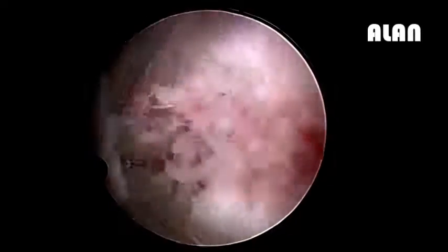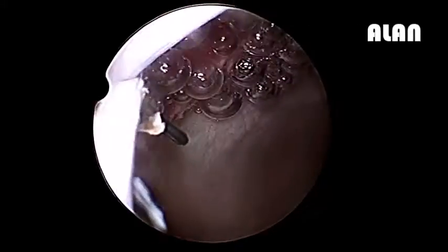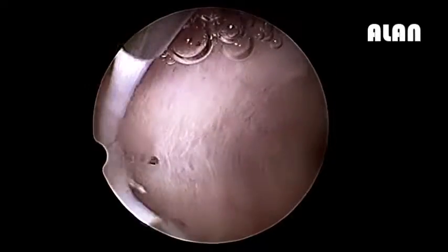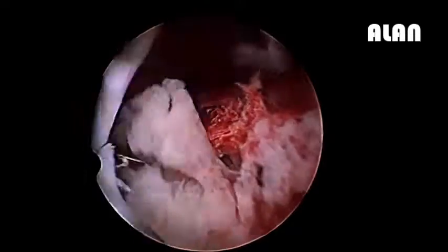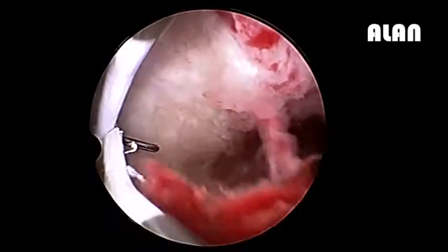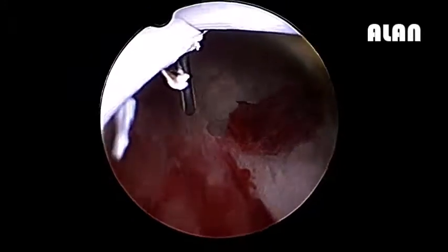Here the choice of resectoscope — is it because of the bleeding? No, not because of bleeding. It's because there is too much of cutting; it will actually break one or two scissors of mine, so it will not be cost effective. Second thing, the cavity is so large that to get distension with an operative sheath is very difficult — it will be mechanically a traumatic surgery for me, not for the patient. Patient will get the same result. Again, we are doing bipolar, so we don't have too much of thermal spread, and we are doing it under water, so that also does not spread too much.